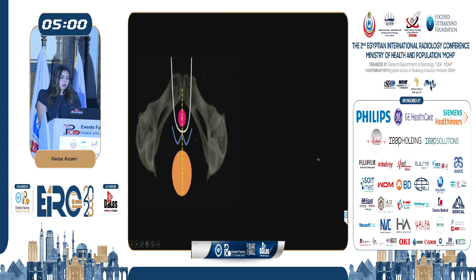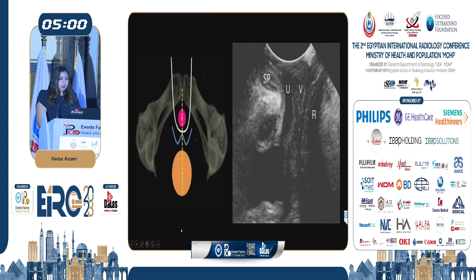The ultrasound beam passes through the pubic bone, then the urethra, vagina, and rectum, and we can see this in the mid-sagittal view. The echogenic structure seen here is the symphysis pubis, followed by the urethra and urinary bladder, the vagina, and the anal canal and rectum. Posteriorly, these are the fibers of the levator ani muscle.